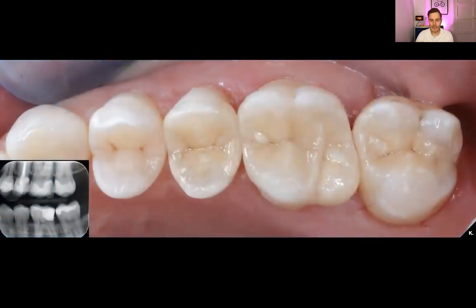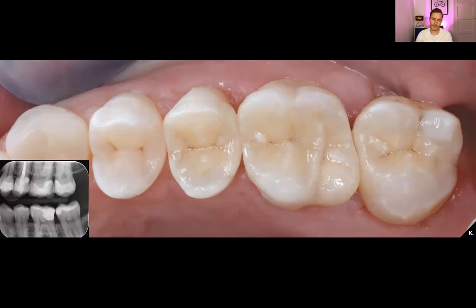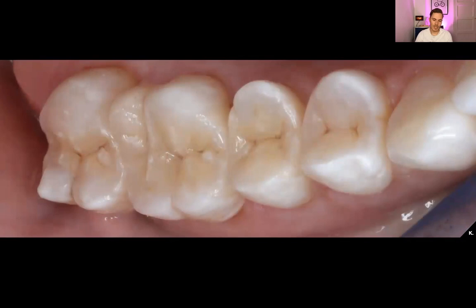Here we can see the situation after removal of the rubber dam, and you can also see the final x-ray of the result. From another angle we can see a really nice integration — it looks really well.